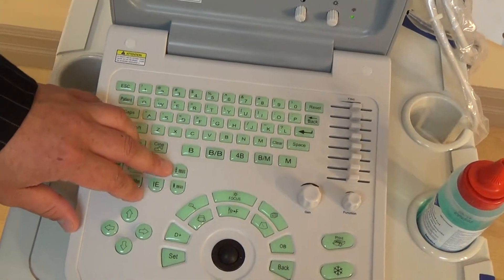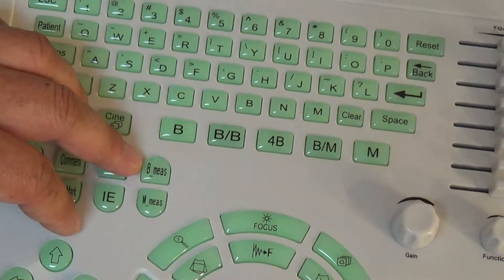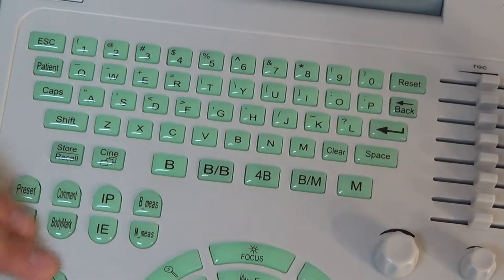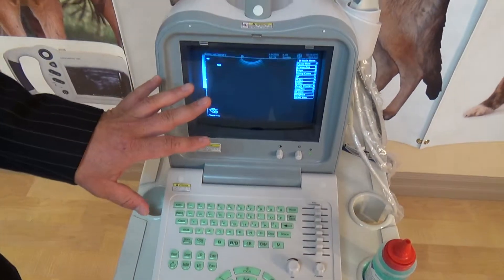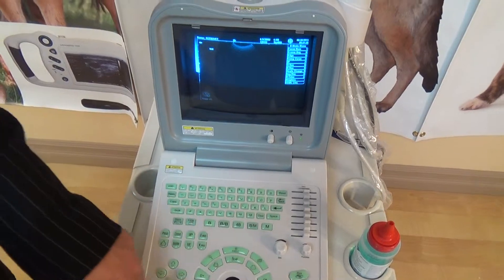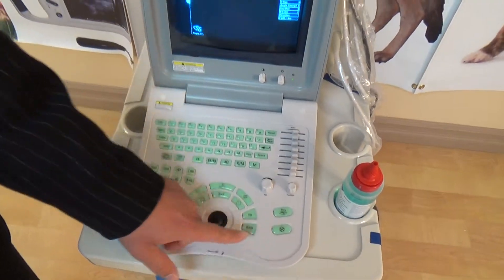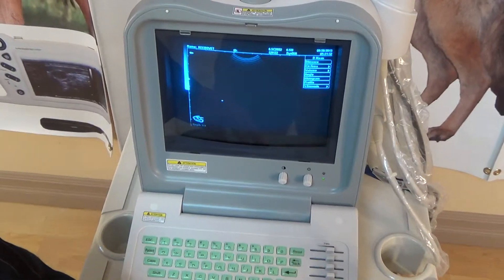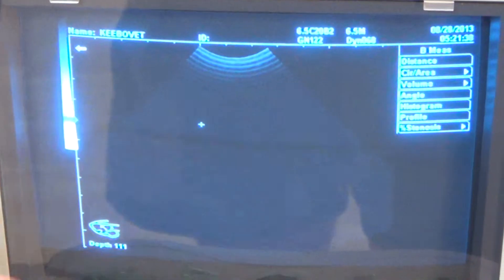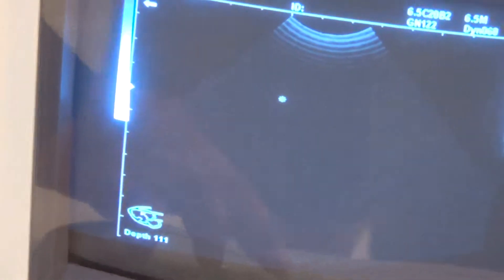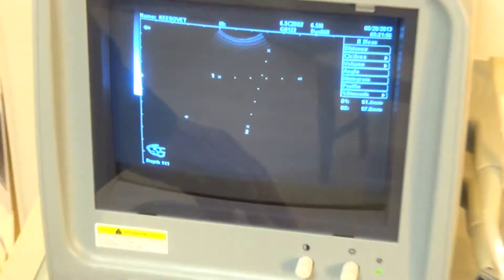The next two buttons that will probably be used often are B-Meas and M-Meas — short for B-measurement and M-measurement. B-mode, which is what we're in, is the standard image. To measure, you hit the freeze button, then hit your B-measurement button, and a cursor with a little plus sign comes up. Let's say you're measuring the size of a cyst, a follicle, or a liver — you set your first point, click Set, and another marker comes up. You move across and you'll have a distance measurement that comes up in millimeters.